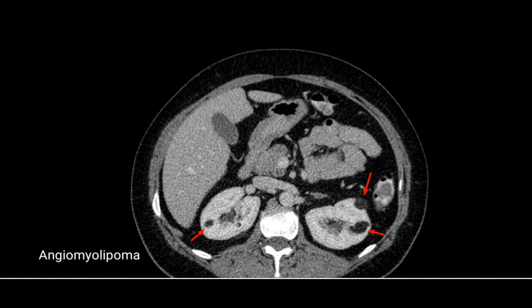Hi everyone. In this video we will be studying the images related to the radiology section which has been frequently asked as previous year questions in NEET PG and INICET. The first image is of angiomyolipoma.